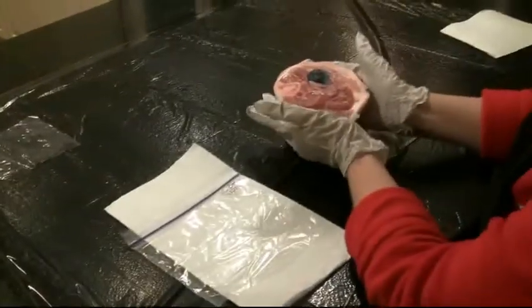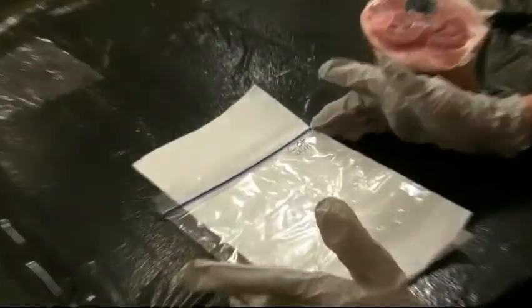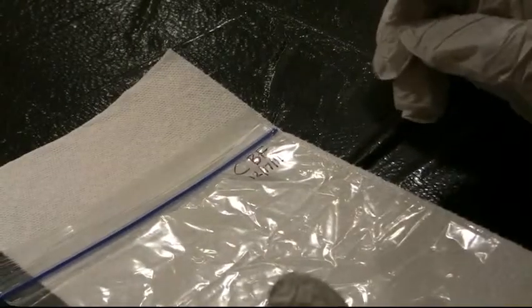Here we go. Here's my ham hock. Here's its necrotic area right here. And I'm getting ready to do the surface drawing. So I have my baggie. I've written my initials here on the top right hand side. I've used my initials this time. And I put the date 12/17/11.